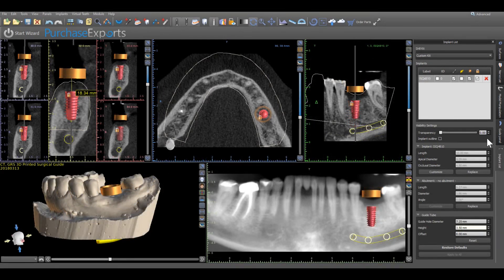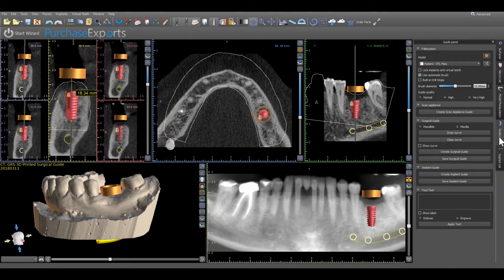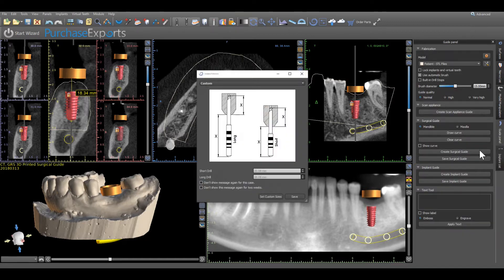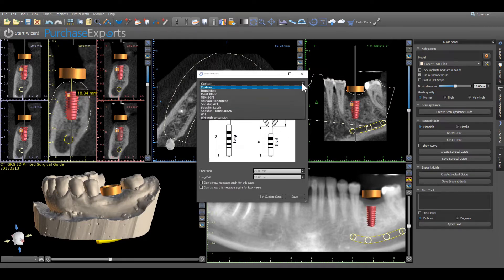Once the surgical guide design is complete, simply click on the Guide Panel tab and then click Create Surgical Guide. If a handpiece preference is needed to establish the length from the tip of the drill to the head of the handpiece, locate the specific handpiece from the drop-down list and click Save.